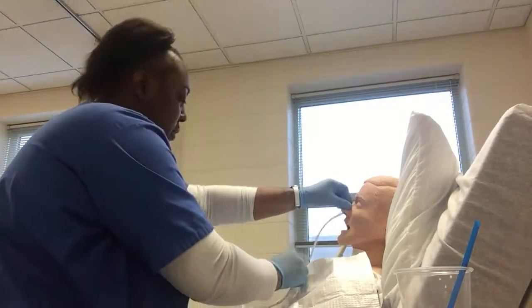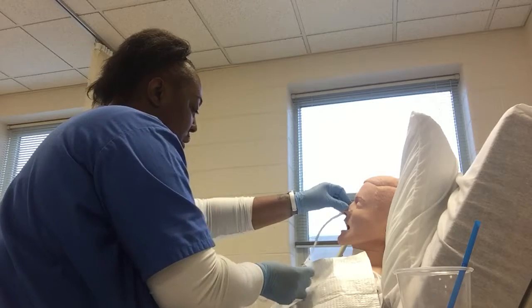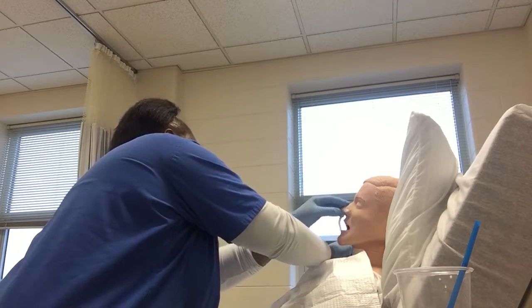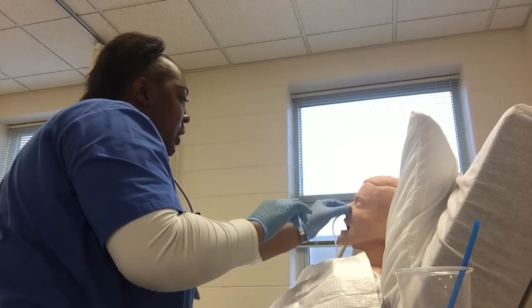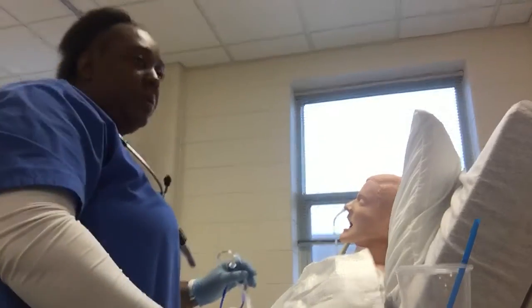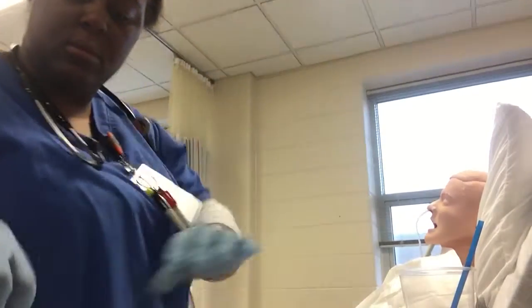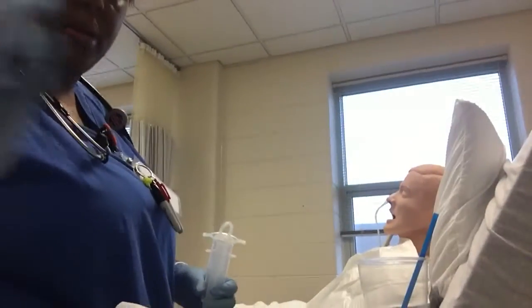The whole time I'll be doing this, I'll make sure that this stays in place so that it's not moving at all. And then I would place this on the patient's clothes, secure that to make sure it's not going anywhere. And once that is secure, at this point I will test pH to ensure that it is properly placed.